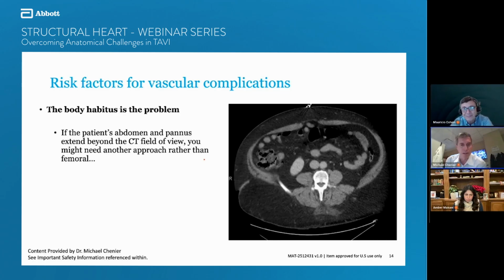Yeah, I 100% agree. I think both of you made perfect points there. For this obese patient in particular, Amber, your point is exactly right. You don't really know until they're on the table and how their weight is distributed, because sometimes getting down to the femoral is actually not that bad. And you can be a little bit fooled by the CT and when you see them in clinic compared to when they lie flat. For that patient in particular, it was incredibly deep down to the vessel. We knew that we did not want to do a cut down, certainly in that situation. The post-op seromas that these patients get are really problematic, plus the infection risk, obviously.